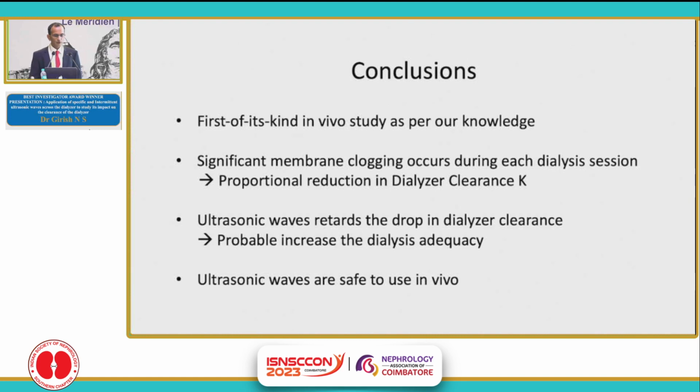So to conclude, this is the first of its kind in vivo study as per our knowledge, which has been performed when the patient is actively undergoing dialysis, and it clearly showed that significant membrane clogging occurs during each dialysis session, as evidenced by proportional reduction in the dialyzer clearance, or the K value.